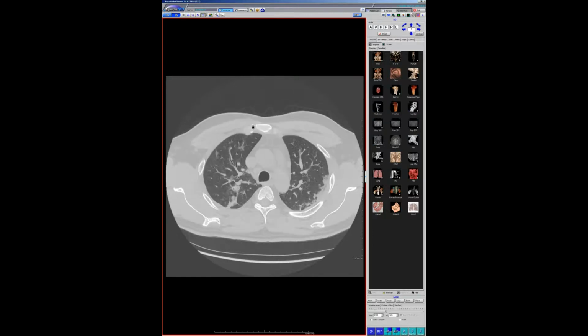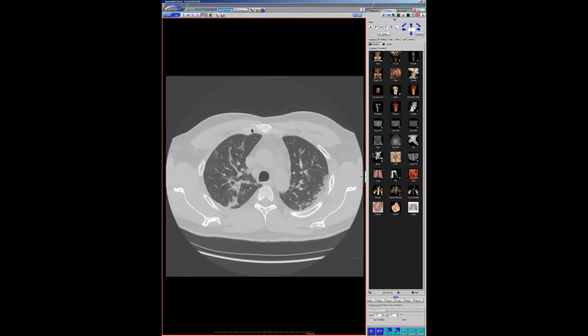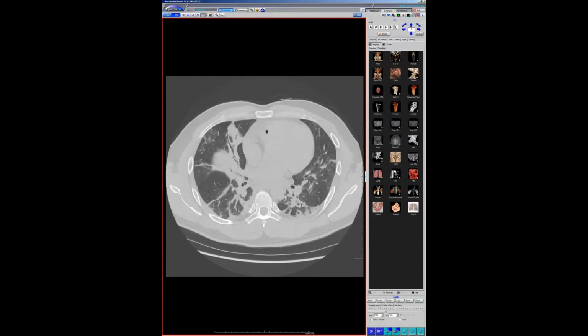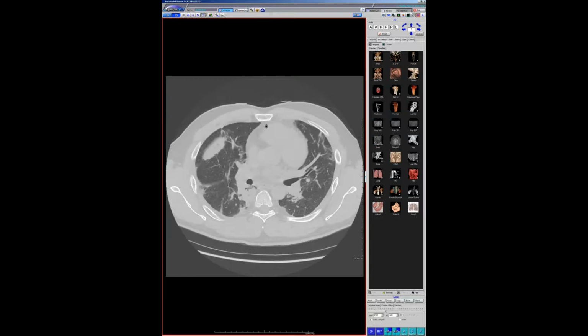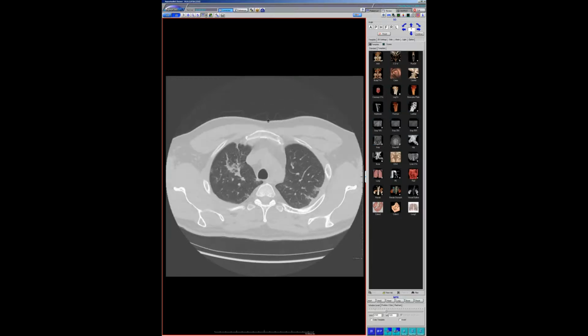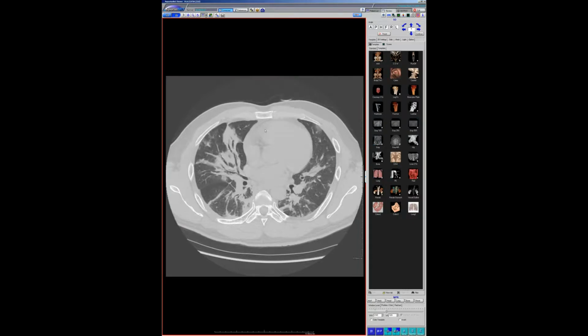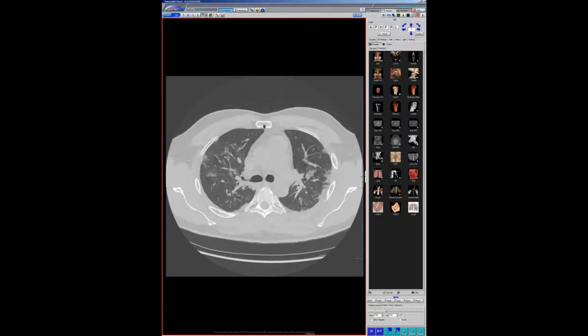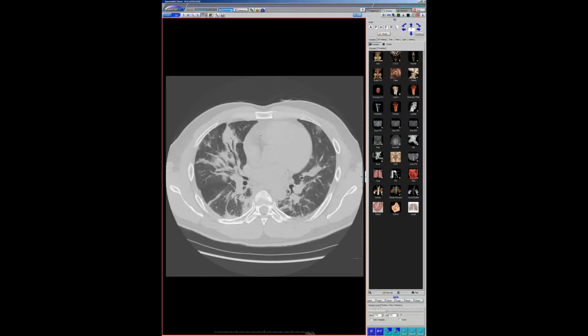Got it. Yeah, no, it's just the logistics. Even if you see a case that you think is positive, are you calling the CT scanner and saying, hey, don't scan any more patients on there, because you're the first one really to see and diagnose the images? Are you even taking that responsibility? Well, fortunately, we haven't gotten to that point yet, because the few that we've scanned so far have been ones where it's at least suspected and they're coming in on precaution anyway, and the scanner's getting closed down regardless of what we see or say. So that's a good point.